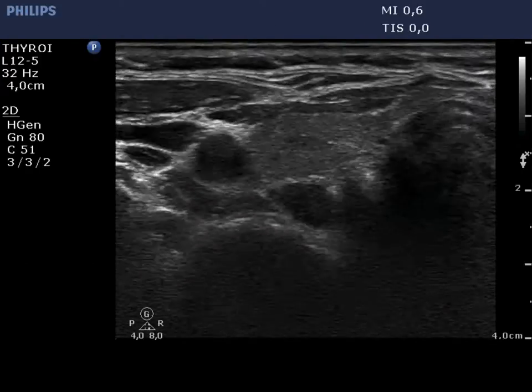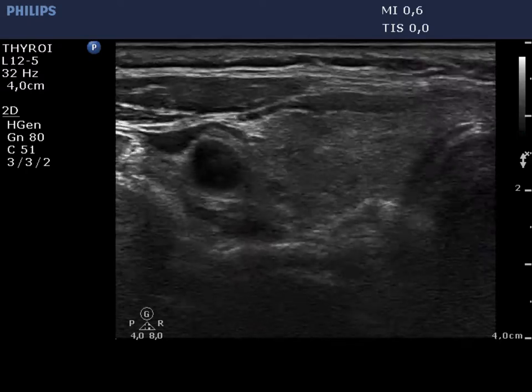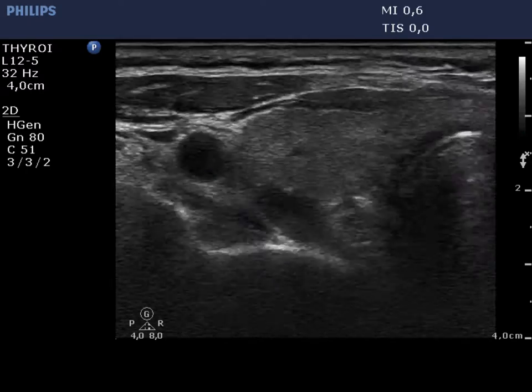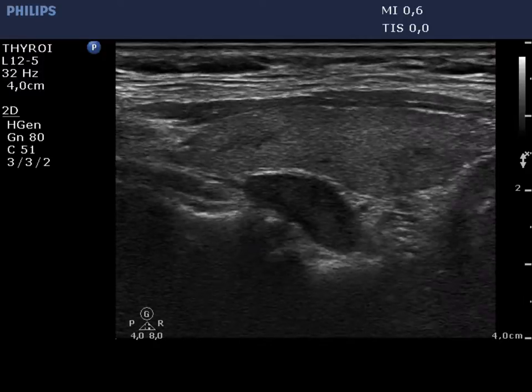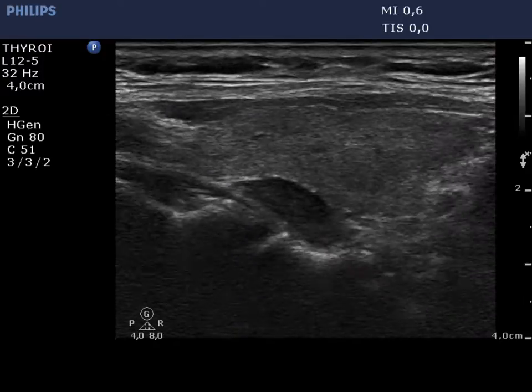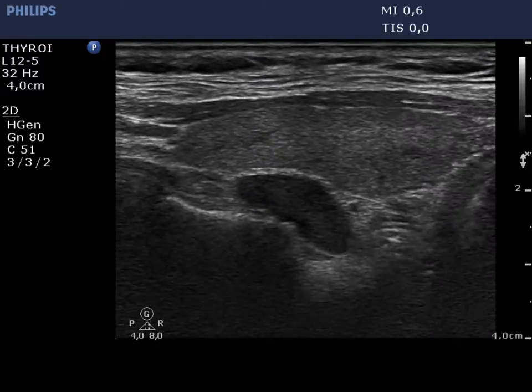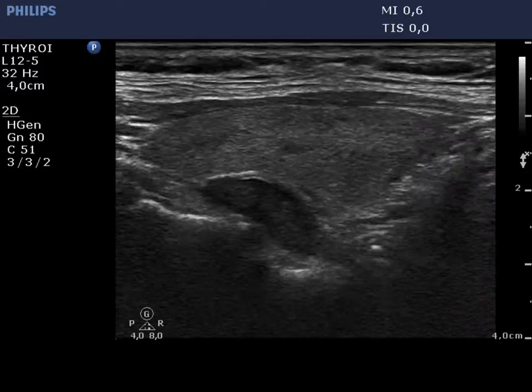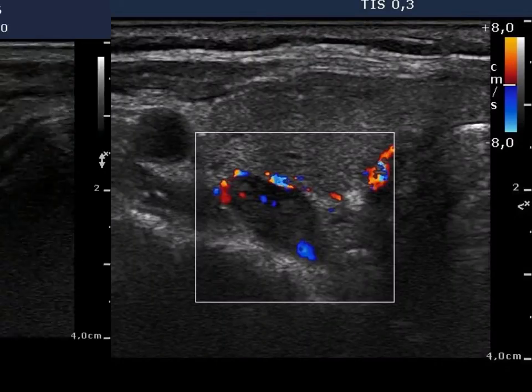The thyroid is moderately hypoechoic, corresponding to the underlying thyroiditis. There is a hypoechoic lesion at the dorsal wall of the lobe. Note the pseudocapsule of the thyroid ventral to the lesion. The feeding artery enters the parathyroid at the lower pole.